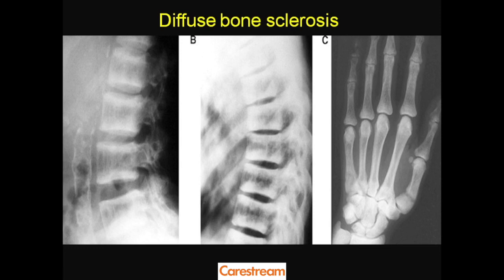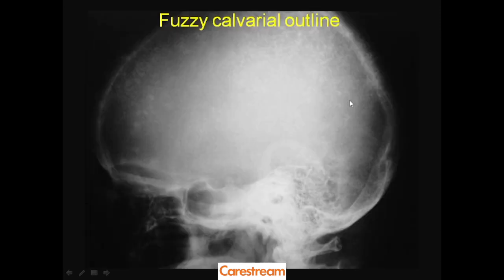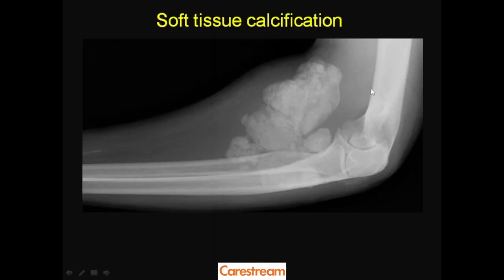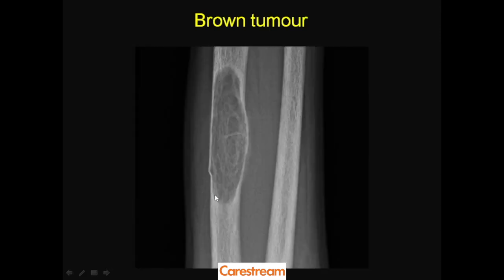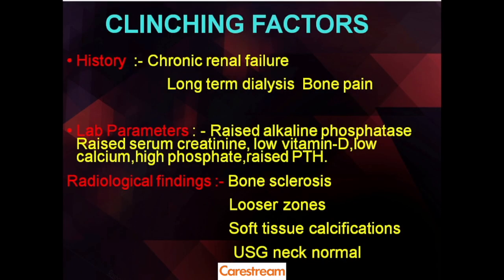Another finding is diffuse bone sclerosis in renal osteodystrophy, which happens because of the anabolic effect of supraphysiologic amounts of PTH on bone metabolism, causing disproportionate osteoblastic activity. I have already shown the rugger jersey spine; similarly, there can be gross osteosclerosis everywhere in renal osteodystrophy. We also see fuzzy outline of the margin of the calvarium due to abnormal osteoid. Soft tissue calcification and vascular calcification are common in secondary hyperparathyroidism. Looser's zones and brown tumors — which may appear in many areas — should not be mistakenly called neoplasms.